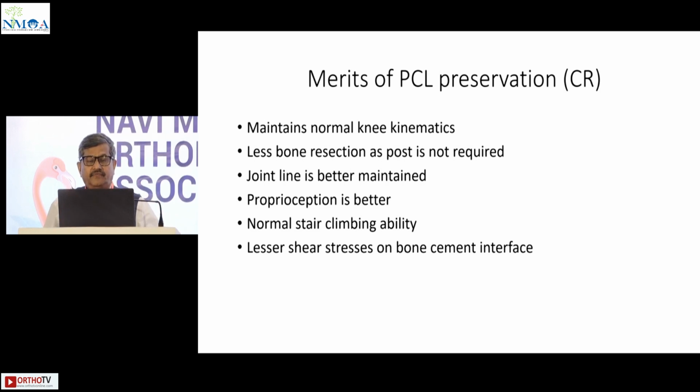Now, merits of PCL preservation or a CR knee: it maintains the normal knee kinematics, less bone resection as the post is not required, joint line is better maintained, proprioception is better, they have normal stair climbing ability, and lesser shear stresses on the bone cement interface.